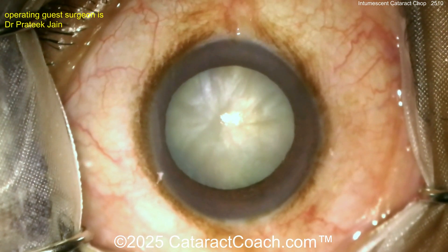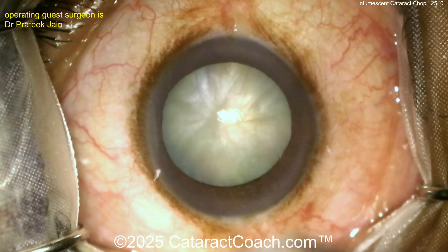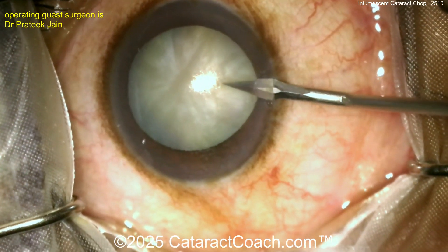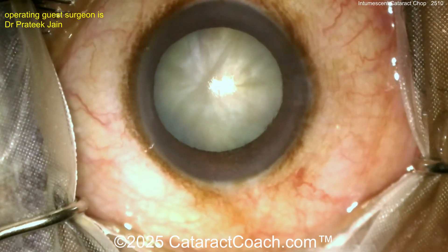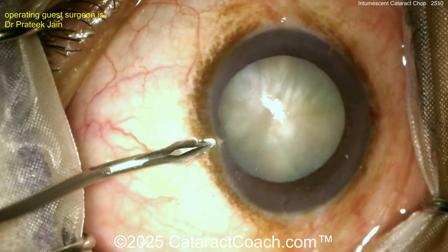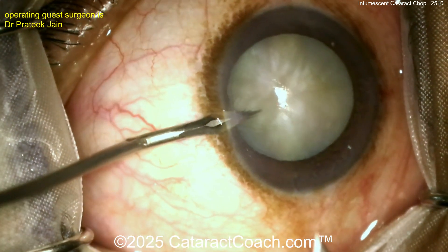It's a good case — we love white cataracts, that's our favorite. You can see certainly a white cataract. Here comes one paracentesis — that's a good start. And now here's the second paracentesis — that's also a good start. So maybe we'll do some bimanual IA on this case, very reasonable.